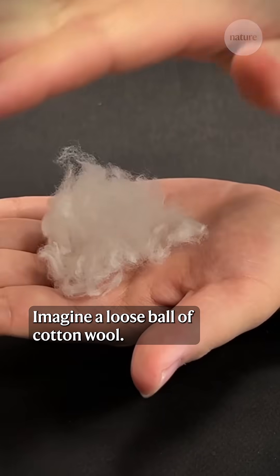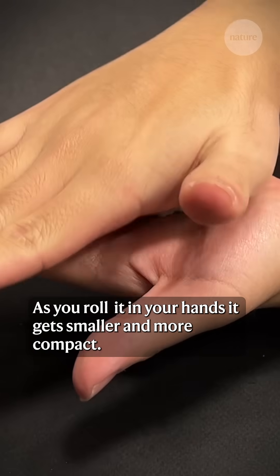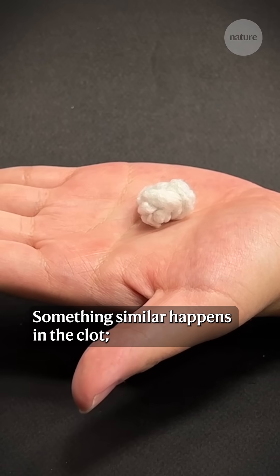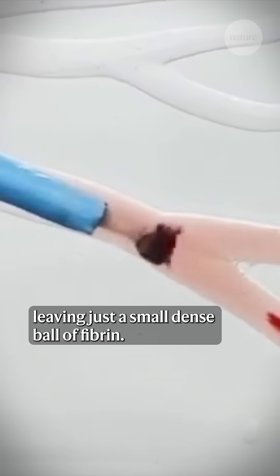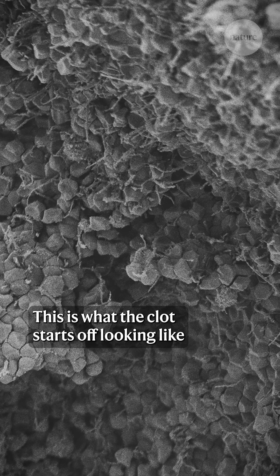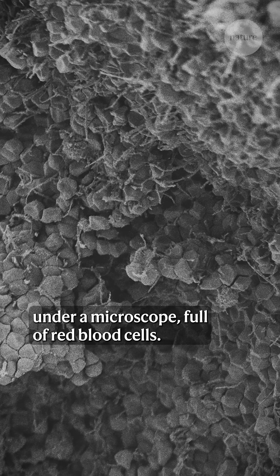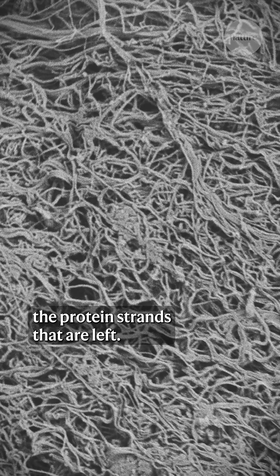Imagine a loose ball of cotton wool. As you roll it in your hands it gets smaller and more compact. Something similar happens in the clot — the red blood cells get squeezed out, leaving just a small dense ball of fibrin. This is what the clot starts off looking like under a microscope, full of red blood cells, and here afterwards you can see the protein strands that are left.